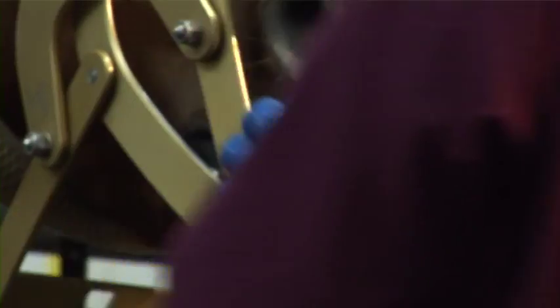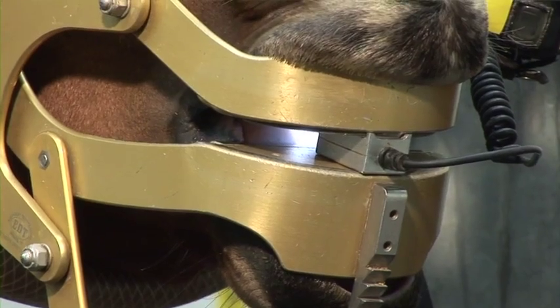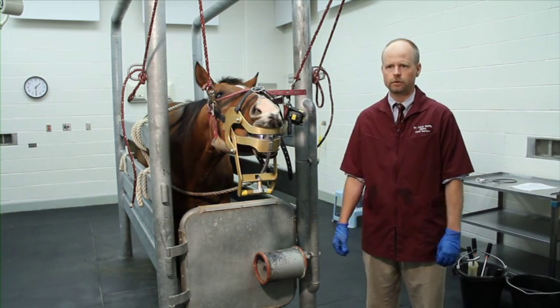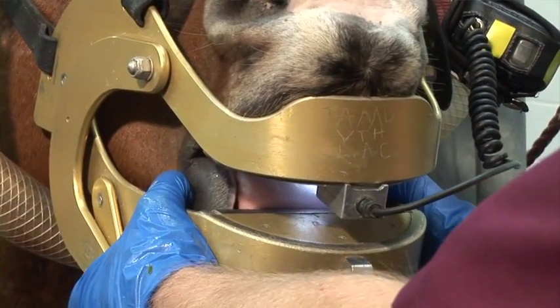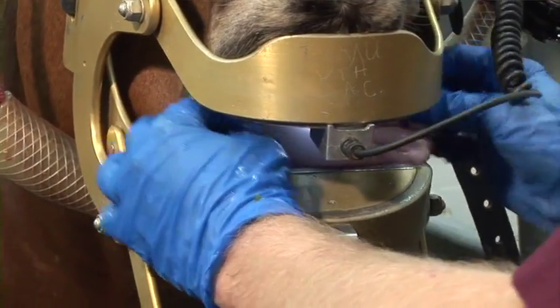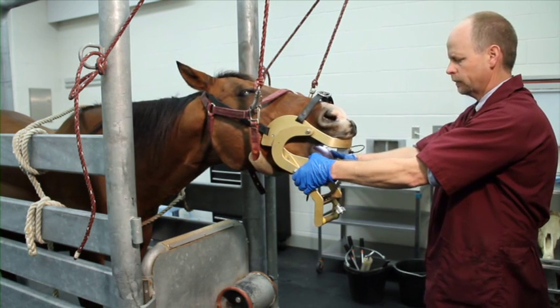We've applied a dental halter to support her head at an appropriate height and placed the dental speculum with the strap secured, along with the light source for the oral examination. We'll open the speculum slightly and make sure the horse is tolerant of having the mouth opened, check that the tongue is not trapped, and confirm the lips look okay. Then we'll open the speculum wide enough to get a good look inside and pass a hand in to palpate the teeth.